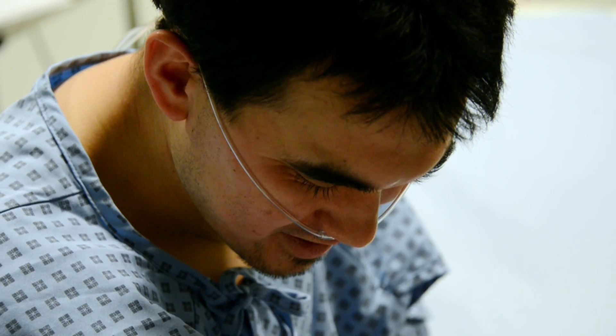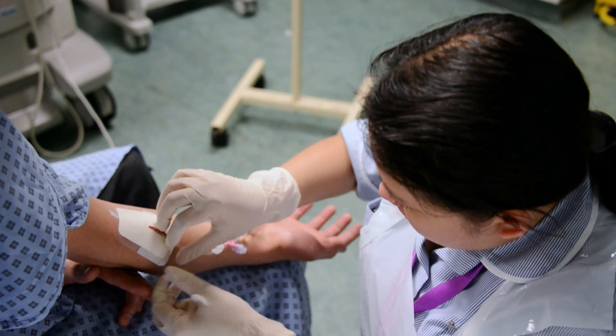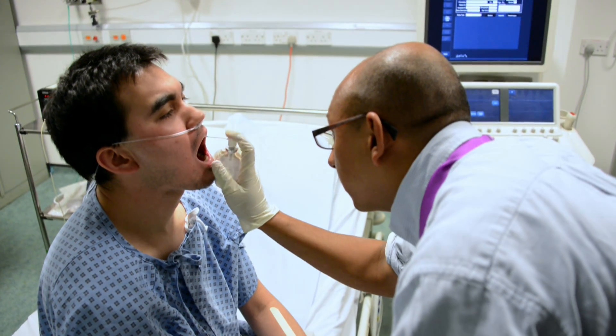An echocardiogram uses the principle of ultrasound to take a picture of the heart. In a smaller number of people, they have to swallow a probe with the ultrasound transducer attached, so we can look at structures at the back of the heart which cannot be as easily seen with a conventional scan.